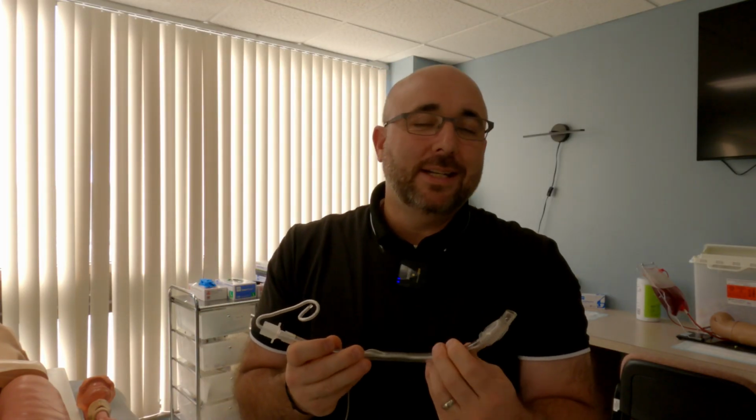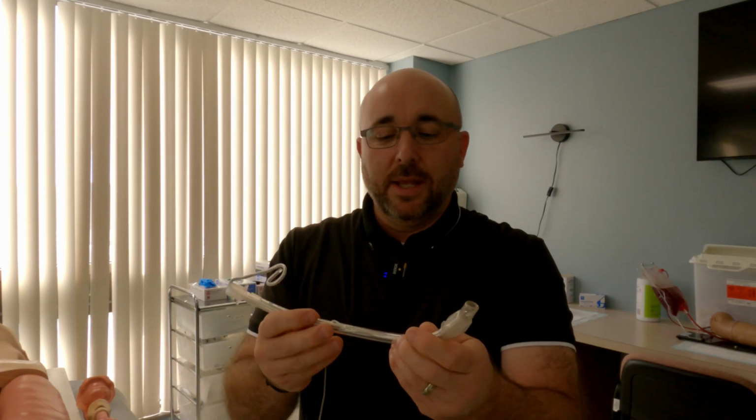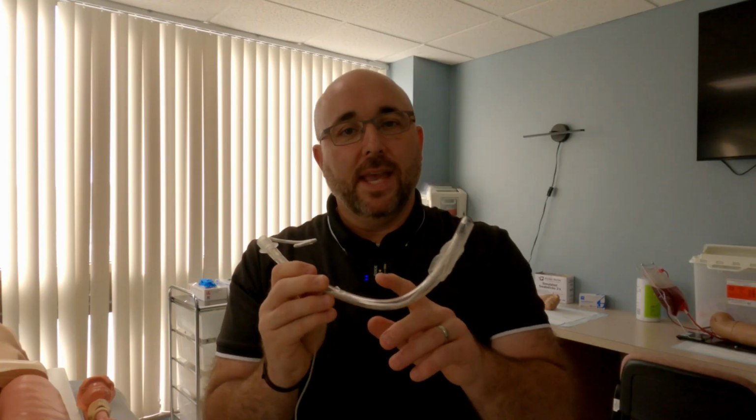If somebody doesn't have a preference and they don't tell you, I usually just put a slight bend on it, something about like this, and then let them actually manipulate that if they need to change it at all. This is usually enough to be able to intubate, and then if they need to bend it any more before they insert it, that's key.